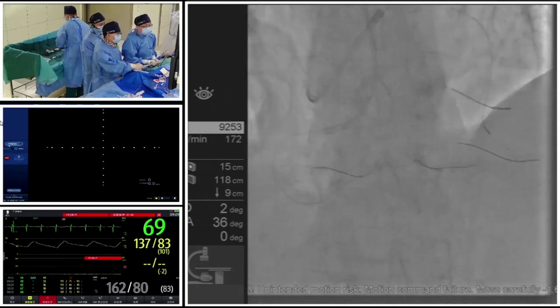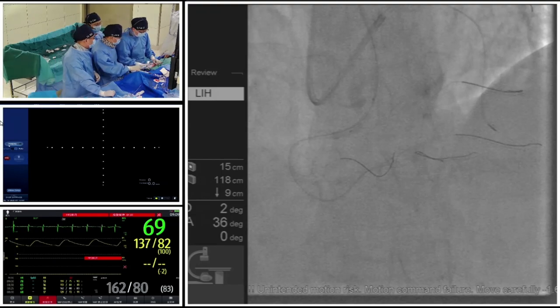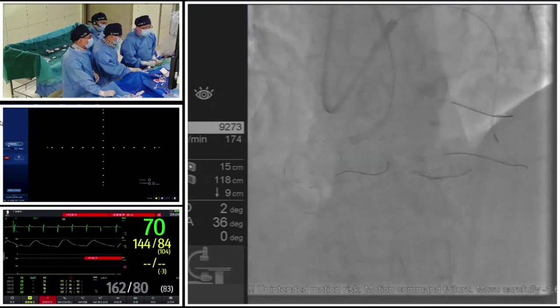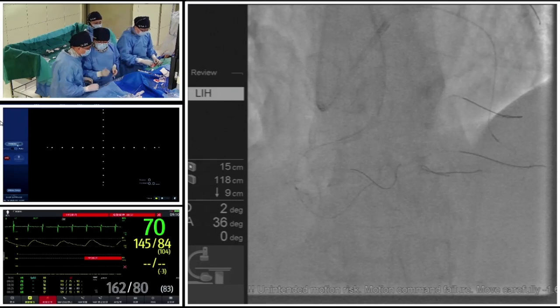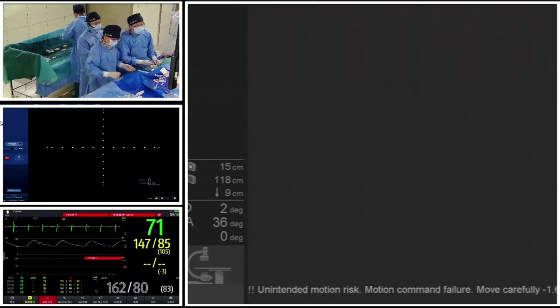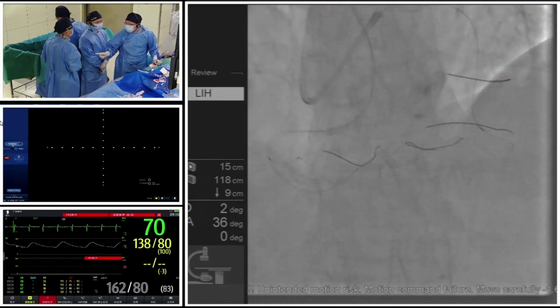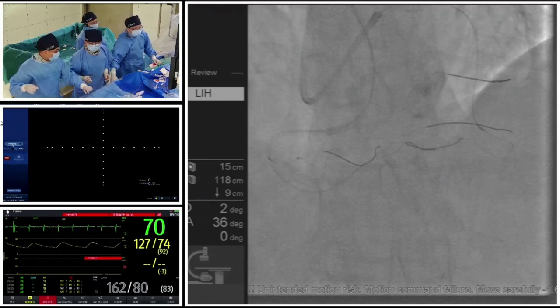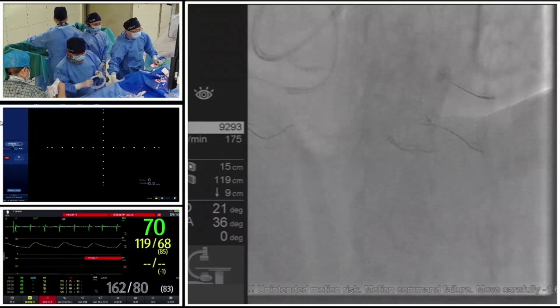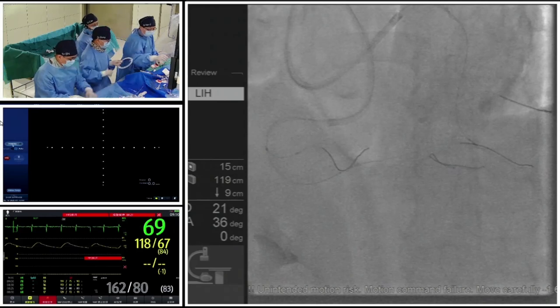Yes. Because under this kind of situation, we use the knuckle technique, and we also push the antegrade Corsair microcatheter directly to the distal end of the CTO segment. So it is of high risk for causing a big hematoma. Although we do not perform the angiography, the blood pressure and the blood are causing the hematoma. We can try some techniques. Some doctors try using a cutting balloon, or a microcatheter or dual-lumen microcatheter, to create a vacuum and reduce the volume and size of the hematoma.